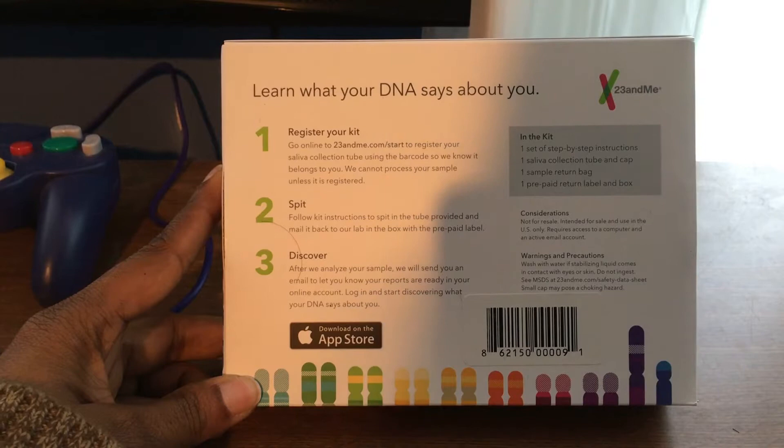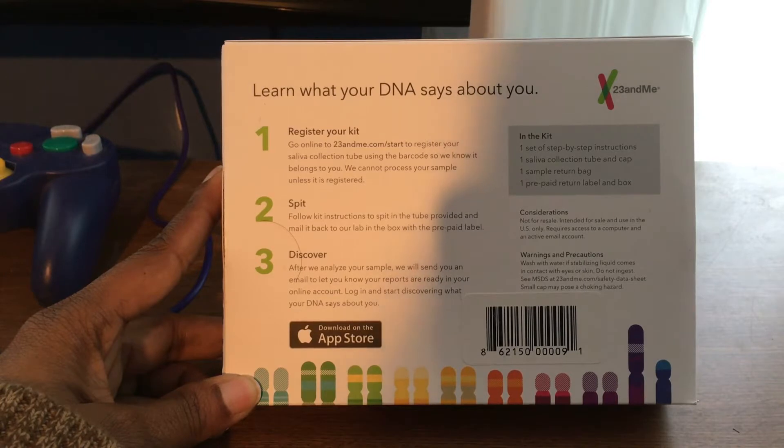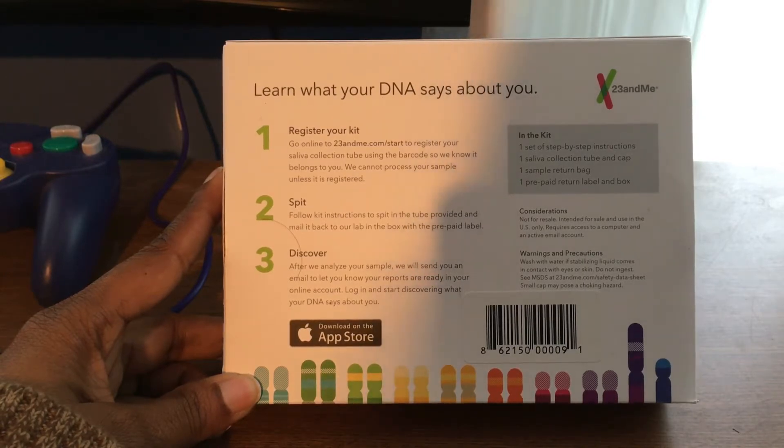I decided to purchase the 23andMe kit to give it a try and learn a little more about my DNA. I got the box and as you can see on the back here, the first thing it says is what you need to do.